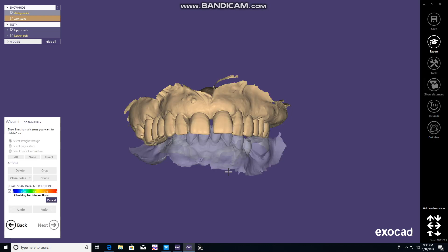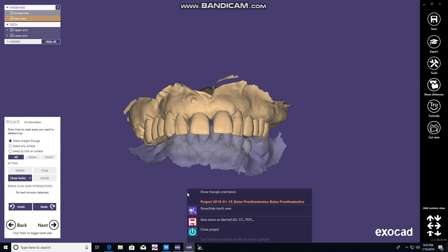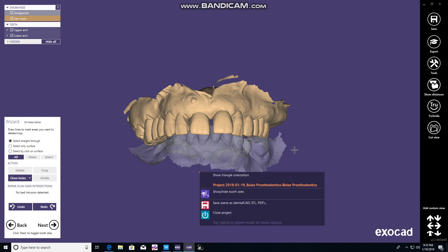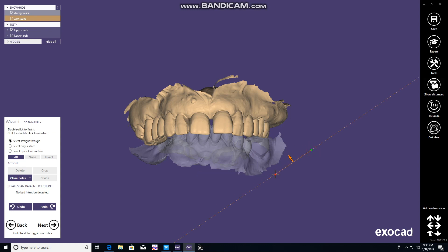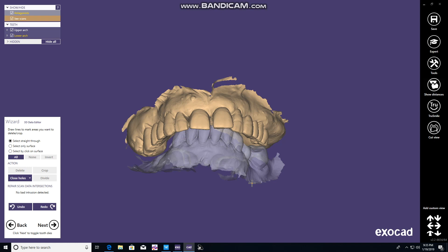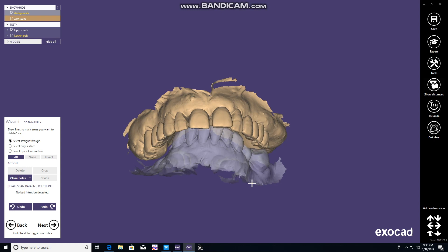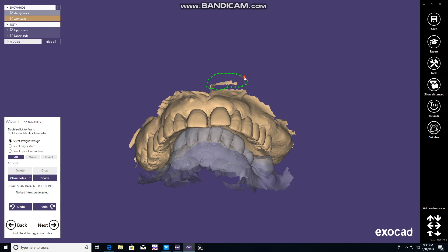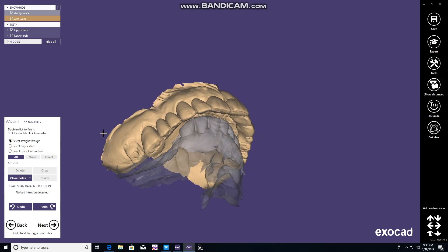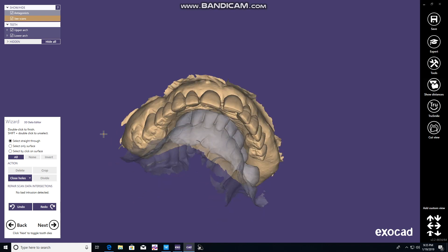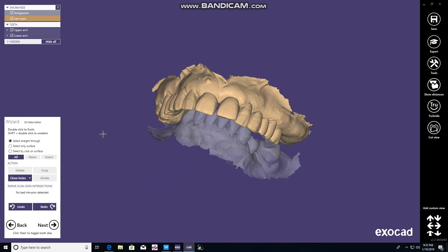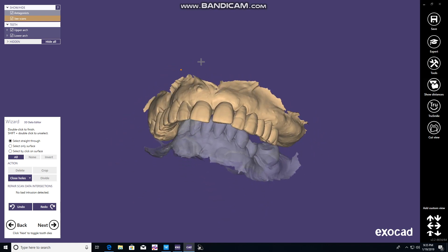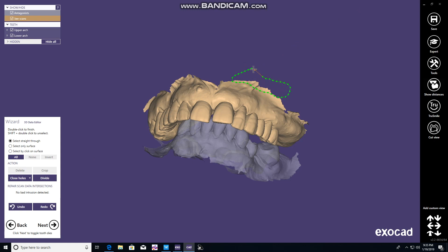I like to say yes, correct the orientation to what we just programmed in. Here you can go in and trim off any excess things you don't like. In our office, we try to scan and gather as much anatomy as we possibly can, so we don't like to remove too much, just these random scraggly things. It's easy - just left click, drag it over any area you want. You'll highlight it, connect the dots again, and hit delete.